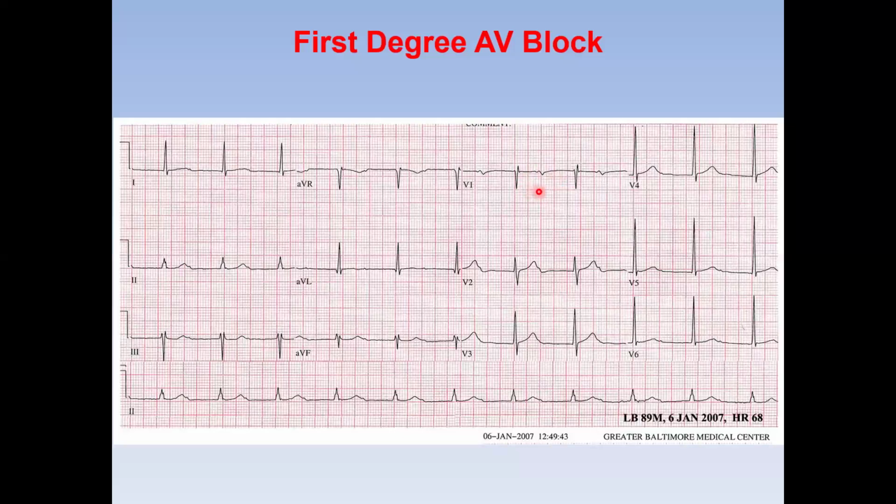There's a P on the T. Sir, there's a P on the T in the rhythm too. Exactly. Now, if you suddenly give this ECG to a young doctor and he says this is a junctional rhythm with U wave, I'm not going to shout at that person. I'll say, look a little bit more.